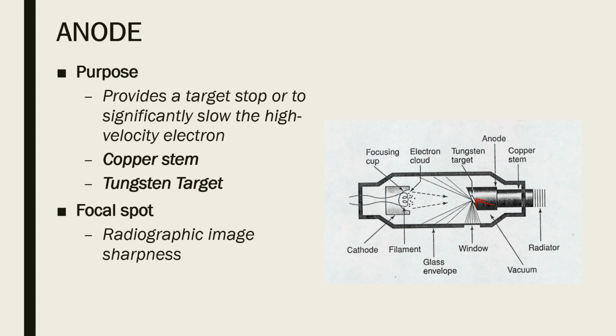That focal spot plays an important role in determining radiographic image sharpness. The smaller the focal spot, the sharper the image produced.